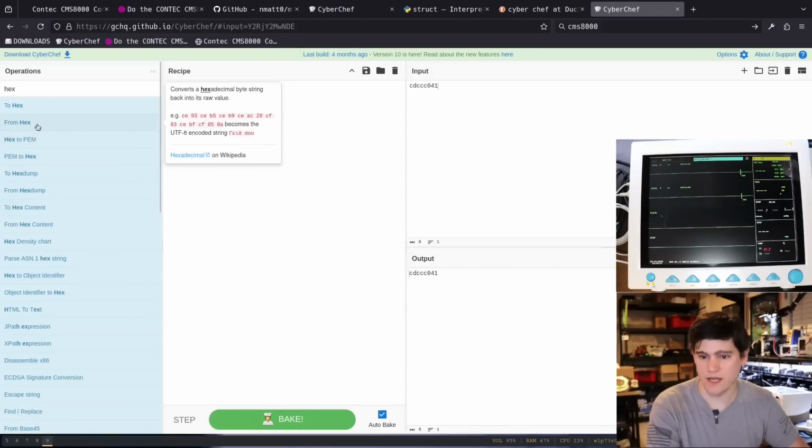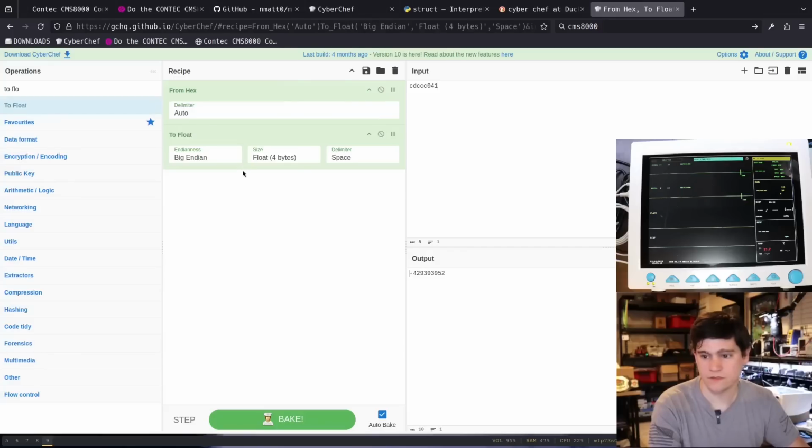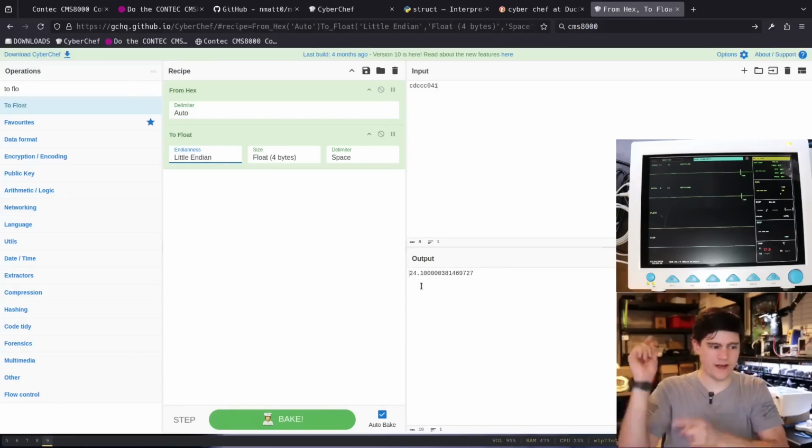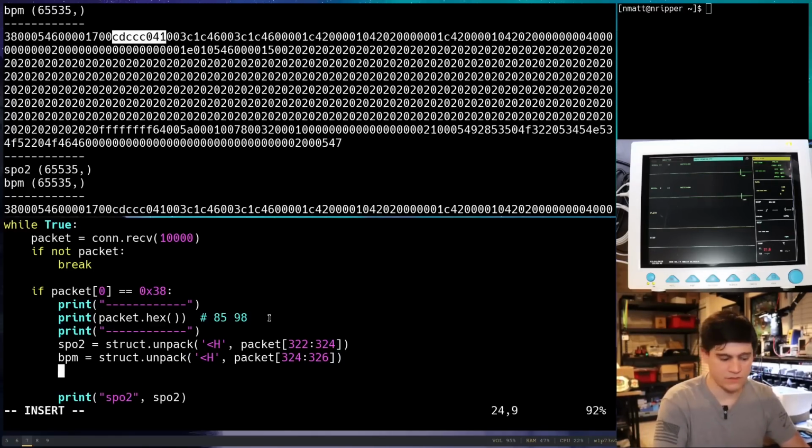So we're going to say from hex, and then we're going to say to float. Oh, I'm doing it wrong. Big endian, little endian. Ah, there we go. We found it, guys. All right. So our offset is 1, 2, 3, 4, we can just count it from the top, 5, 6, 7, 8. Okay, so there it is. 8. All right. So now we're going to just call it T1, temperature 1, struct unpack.